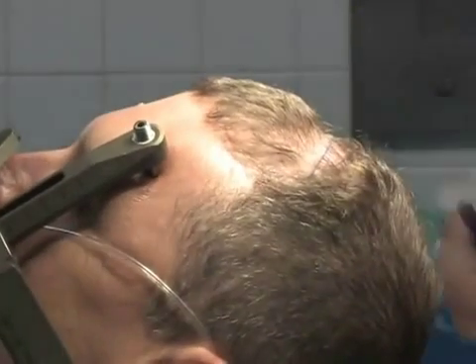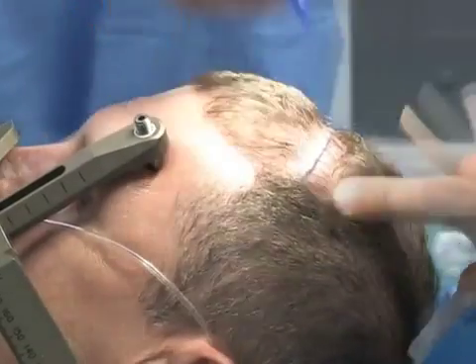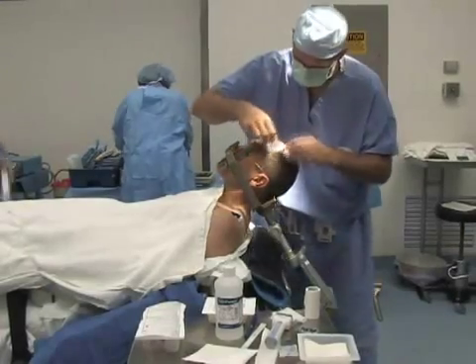At some centers, a full head shave may be performed. Ask your surgeon about any options. Your head is then cleansed and draped.